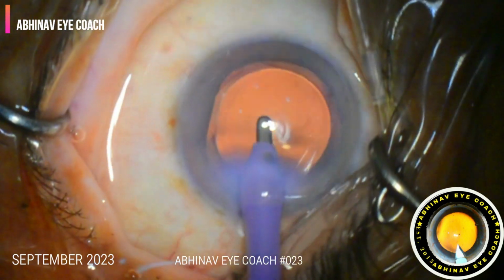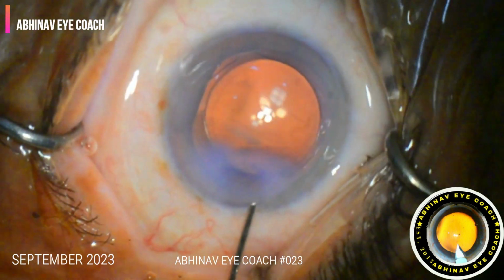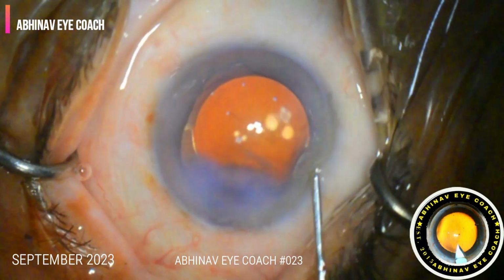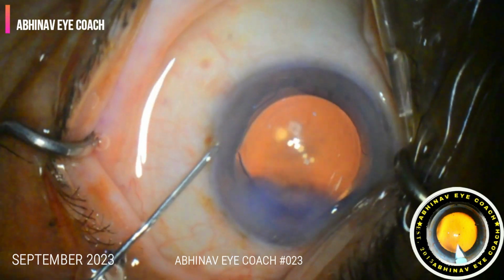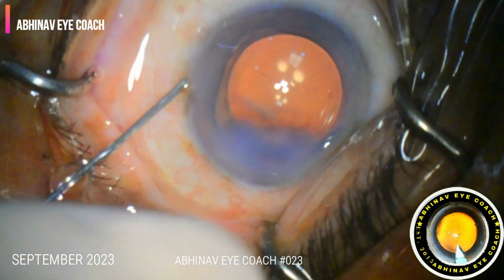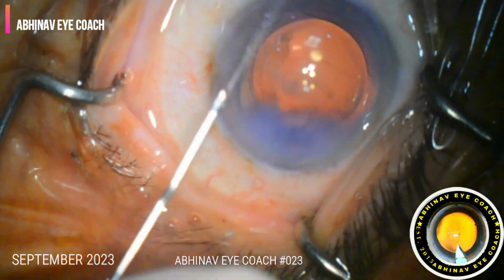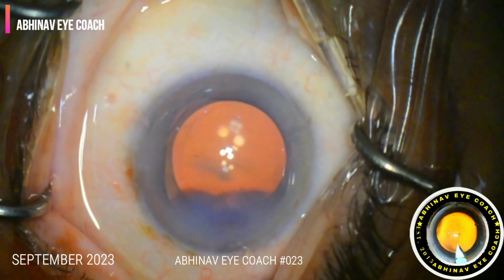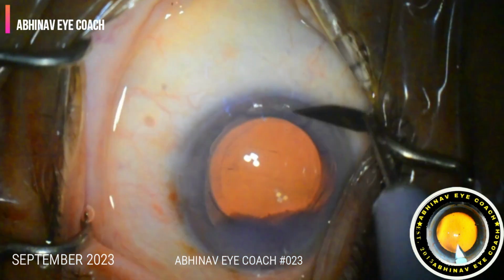See the three lights on the cornea and three lights on the IOL. These lights are called Purkinje images, and these three lights should coincide with each other. Especially in these premium lenses like extended depth of focus and trifocal lenses, the results depend very much on the Purkinje image overlap. The patient will see very good three-dimensional vision if we overlap these two lights. See how nicely these two lights are coinciding. So this will provide very good visual outcome.